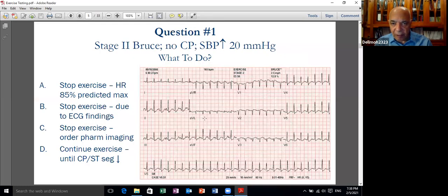But you can, if the patient is having Q waves in the right precordial leads, then this is a reciprocal movement because of the presence of a scar in that territory. So the important point is that if you get ST elevation in leads that are not carrying a QS or a QR complex, that's a very significant indication of severe ischemia, severe stenosis in the supplying vessel, as well as a strong absolute indication for termination of the exercise test.